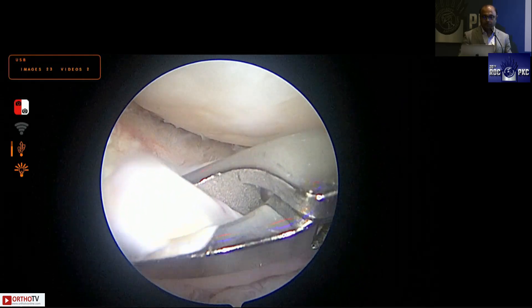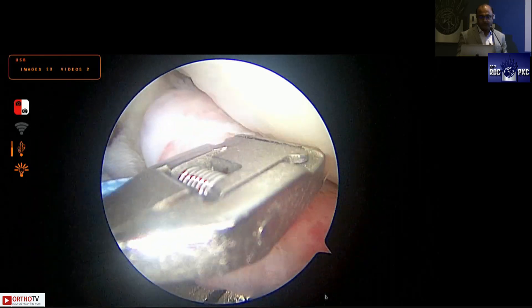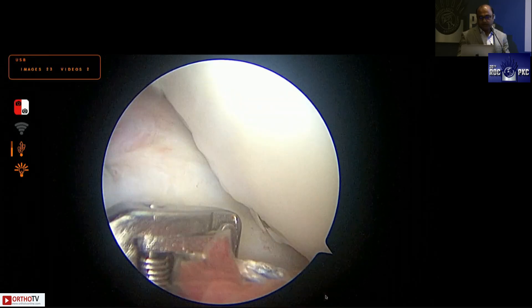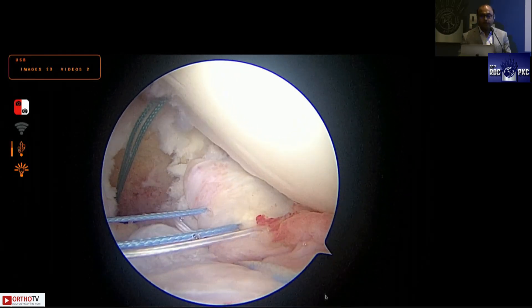Another lateral meniscus root avulsion where the entire root is avulsed — this is where the utility of the shoulder scorpion also comes in. A soft anchor has been placed and then the shoulder scorpion is used. Left knee, visualization from the anterolateral portal, passport cannula in the medial portal, soft anchor double-loaded. The sutures are loaded onto the shoulder scorpion — because these are number two sutures, remember the knee scorpion takes only zero and two-zero fiber wire; you cannot load a number two suture, so the shoulder scorpion is needed. Two bites are taken, the third suture is loaded with traction on the previous sutures, protecting the cartilage to create mattress sutures for a robust lateral meniscus root repair.